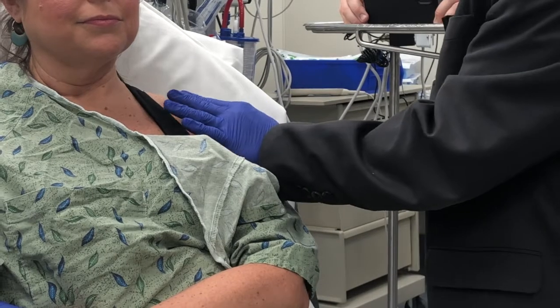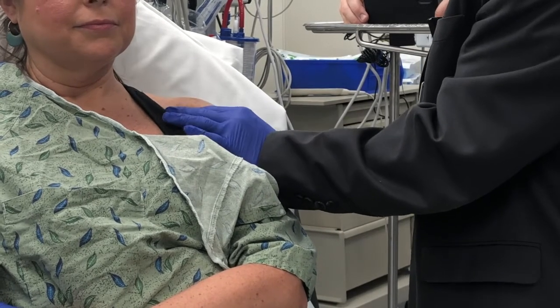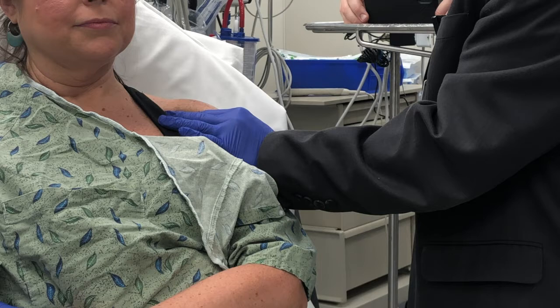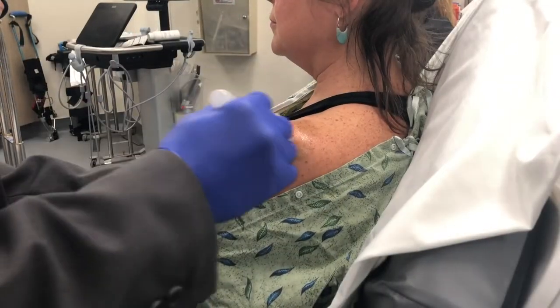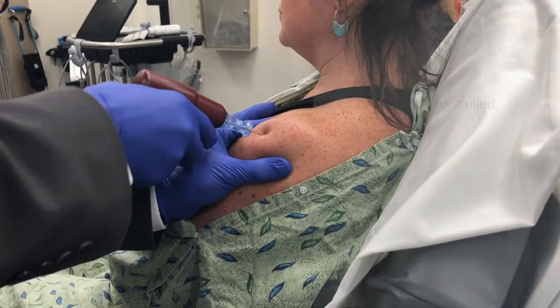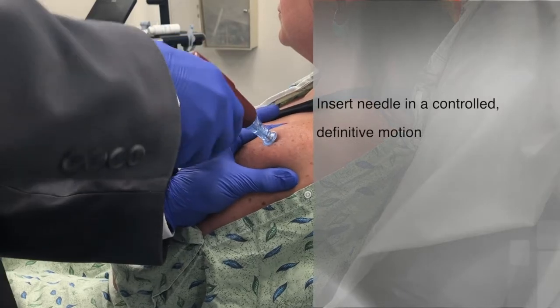Here we show the insertion of the EZ-IO device in the humeral head. The humeral head is most easily palpated with the patient's elbow bent and their hand across the abdomen. Feel for the bony prominence of the humeral head at its greater tuberosity. Cleanse the skin with chlorhexidine. Insert the needle through the skin to the hard bony surface in a definitive controlled motion.